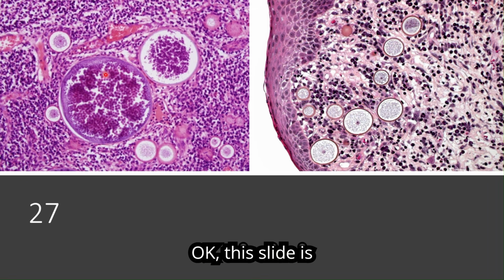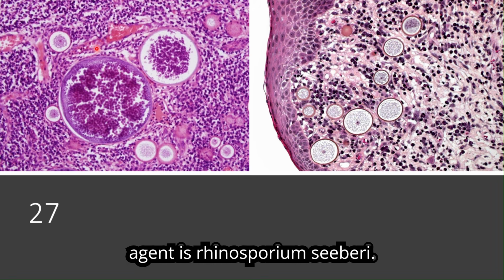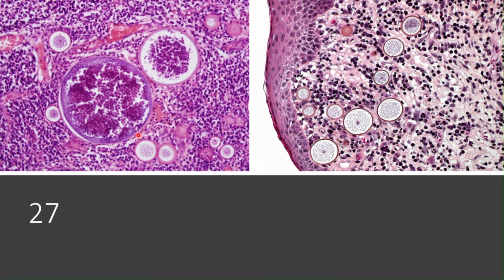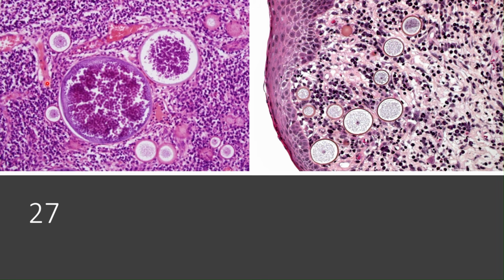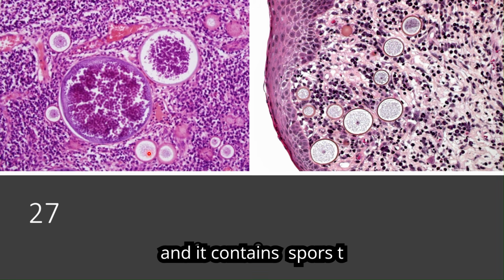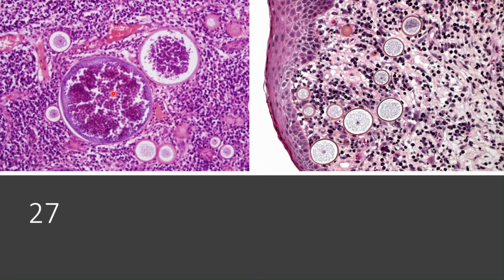Okay, this slide is a case of rhinosporidiosis in which the infective agent is Rhinosporidium seeberi. This is the sporangia, and it contains multiple spores.